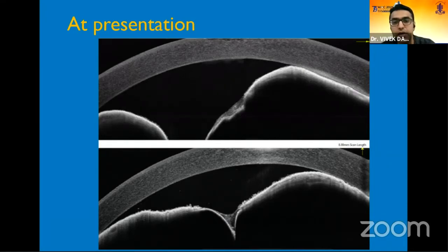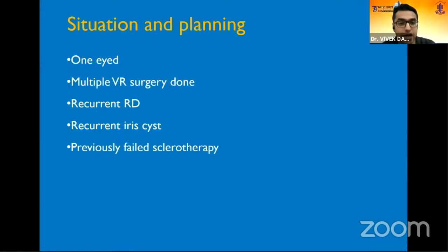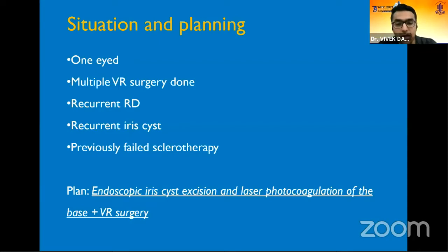The clinical situation we faced was a one-eyed patient with multiple VR surgeries already done, recurrent retinal detachment present under oil as seen on B-scan, recurrent iris cyst, and previously failed sclerotherapy done elsewhere on multiple occasions. We planned an endoscopic iris cyst excision and laser photocoagulation of the cyst base, along with VR surgery for oil removal and repair of the retina.